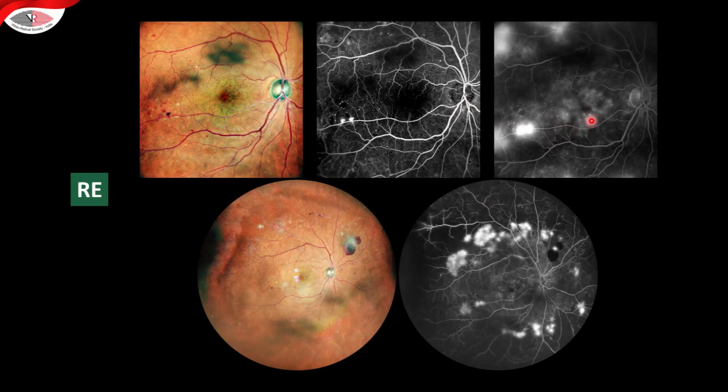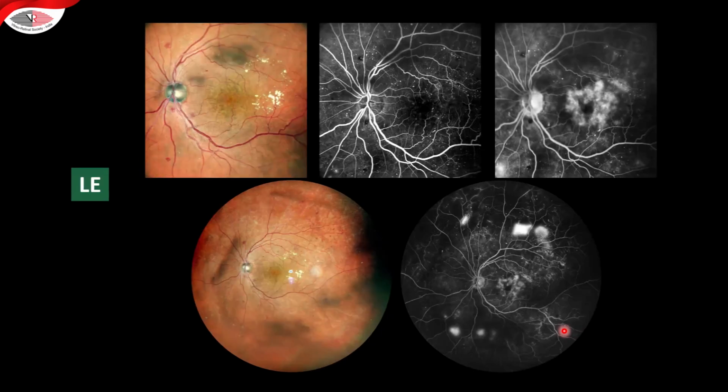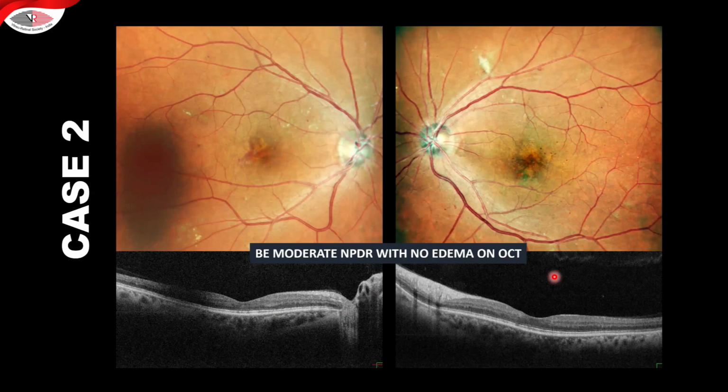You of course see the macular edema, which you had noted already with the OCT, but you also see the whole peripheral changes of how the fronds are leaking in the periphery, and it tells you that the patient needs aggressive laser and injections to stabilize this retinopathy. This is the other eye, and you can see a similar kind of picture on the macular area, which is a diffuse cystoid petaloid appearance, and then you see the fronds in the periphery, which warrant treatment.